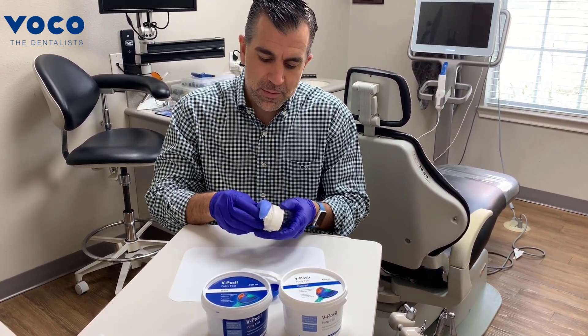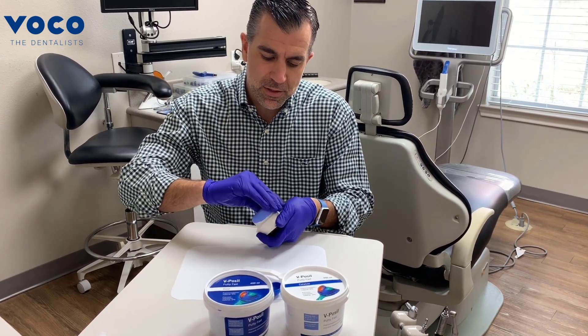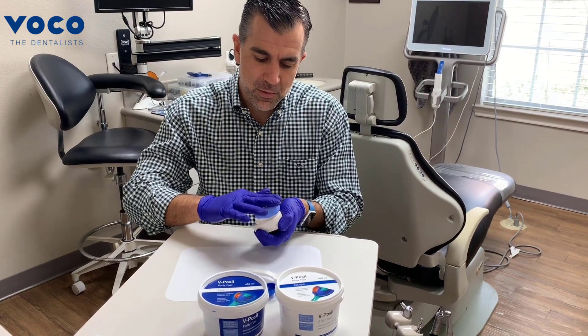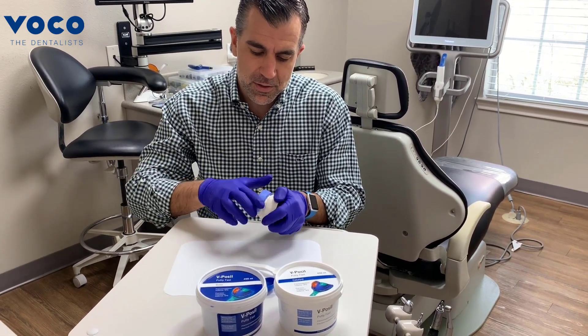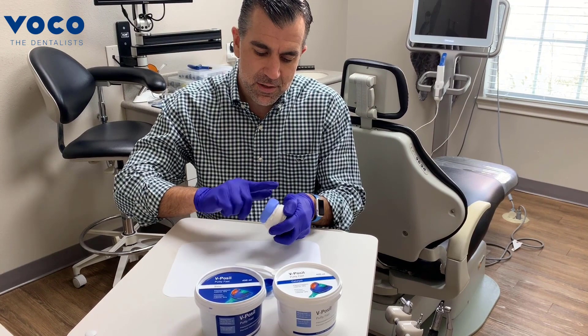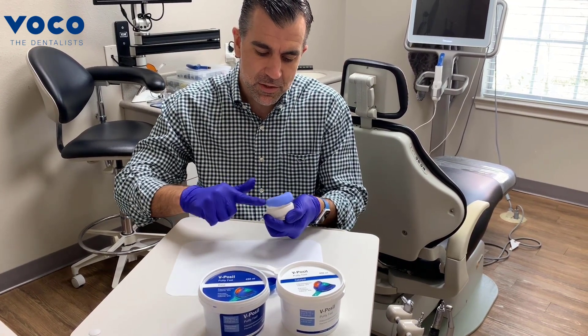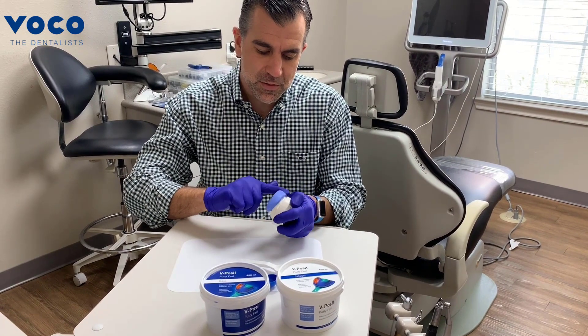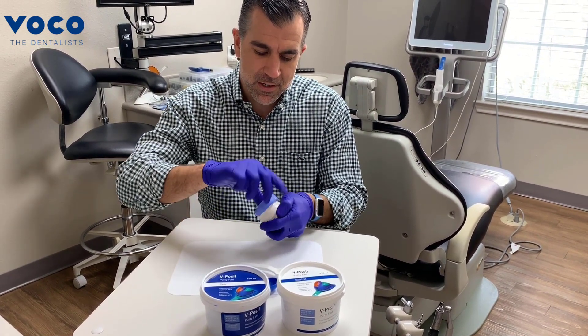Don't worry about full adaptation because on the next step we're going to talk about relining this, and we'll also discuss further uses of putty matrices in other videos. Just try and even it out as much as you can and try to get rid of all the ripples — that's really just for us and our sanity as dentists.